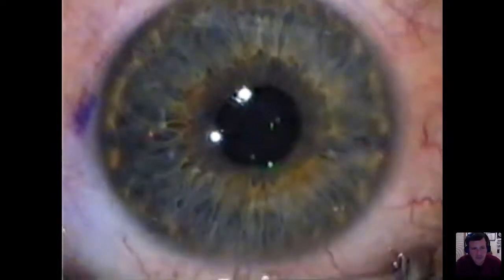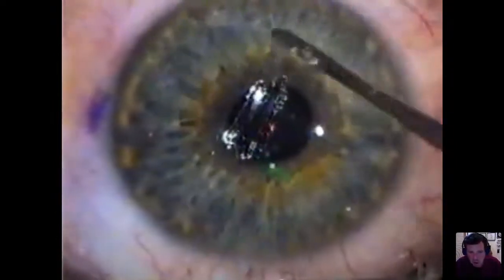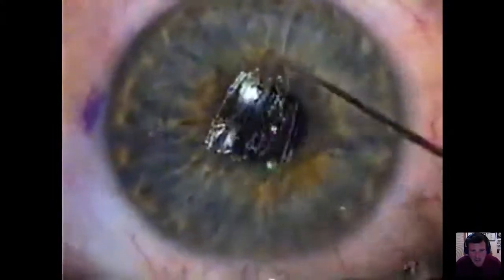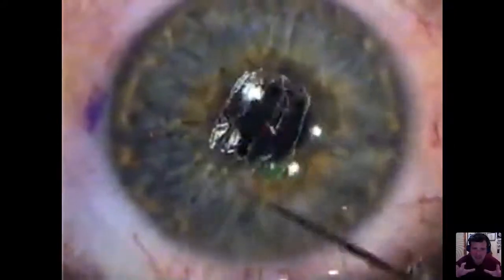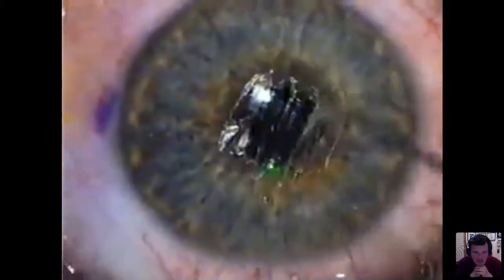Anything to listen to. So here you're going to see a patient going for PRK, and they're going to remove the epithelium. What I want to show you with this is look how hard the surgeon is scratching the cornea. You can see the cornea is indenting. They're using a lot of pressure there and scraping away, because they have to get down to that anterior Bowman's to reshape, because it's a photorefractive keratectomy.